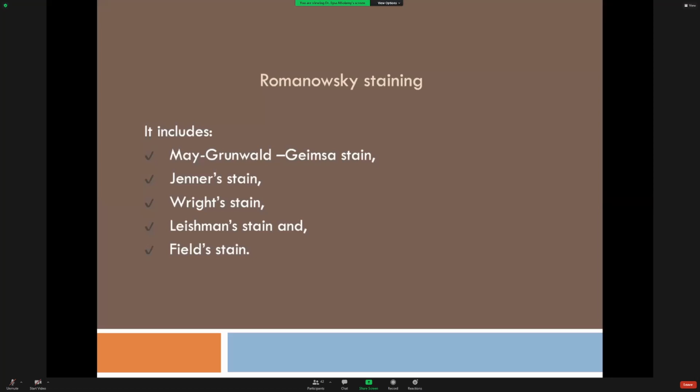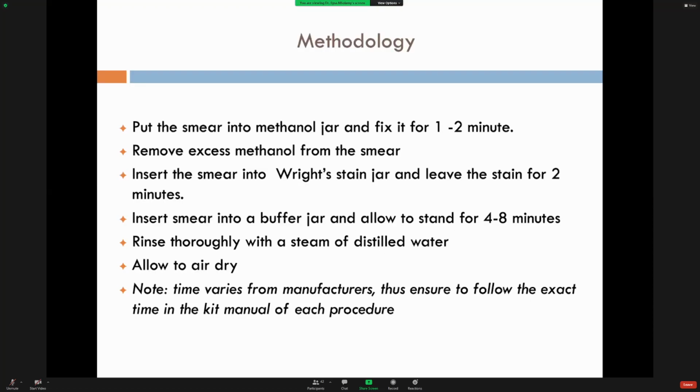The most important of them is Wright stain, but others can be Romanowsky staining. It's a common category. الميثودولوجي غير مطالبين فيه. اللي يبغى يقرأ ويستفيد منه مهم جدا. Later on, لو واحد حابب يفكر في الهيماتوباثولوجيست ولا الهيماتولوجي تكون عنده concept about how the peripheral blood smear preparations.